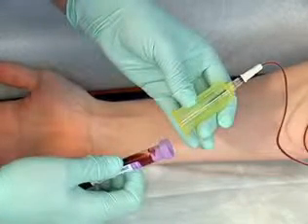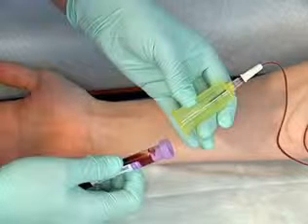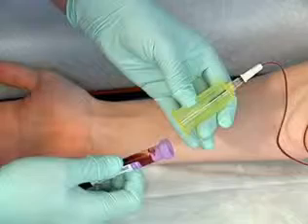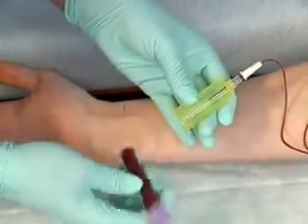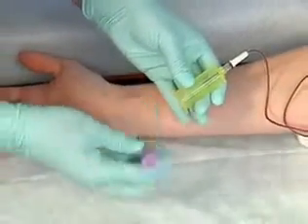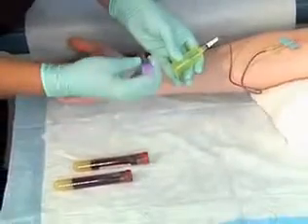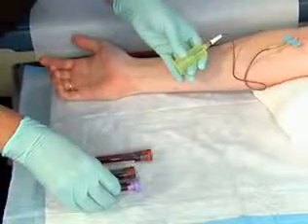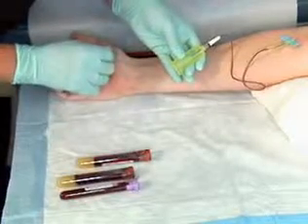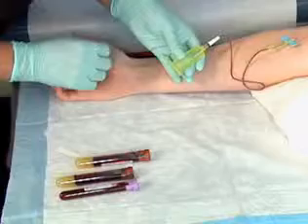Removing the last tube prevents blood from dripping out of the tip of the needle after it is removed from the patient's arm. Since lavender tubes contain an anticoagulant, gently invert the tube back and forth 8 to 10 times before laying it down. A tube containing an anticoagulant must be inverted immediately after drawing it to prevent the blood specimen from clotting. Careful mixing of the blood with the anticoagulant prevents hemolysis.